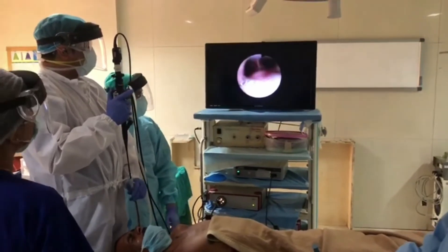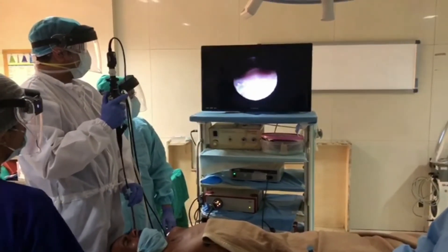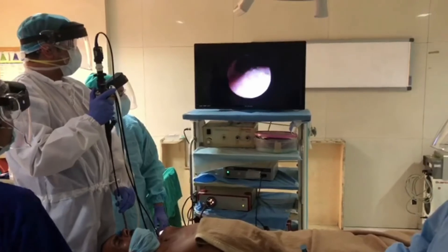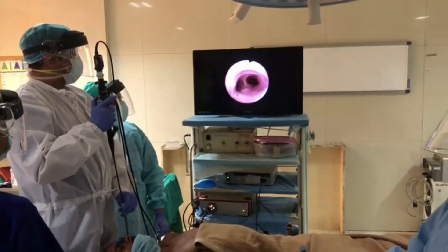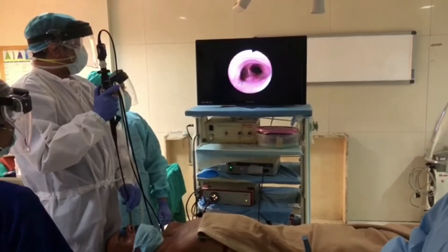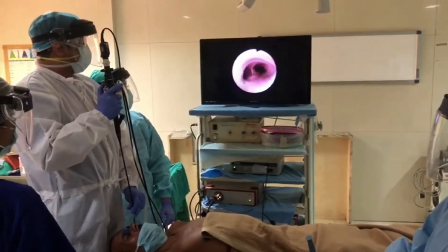Once we reach the carina, the flexometallic ET tube is slowly introduced through the nose to the trachea, just above the carina, and the bronchoscope is slowly taken out. The ET tube cuff is inflated and attached to the ventilating circuit.